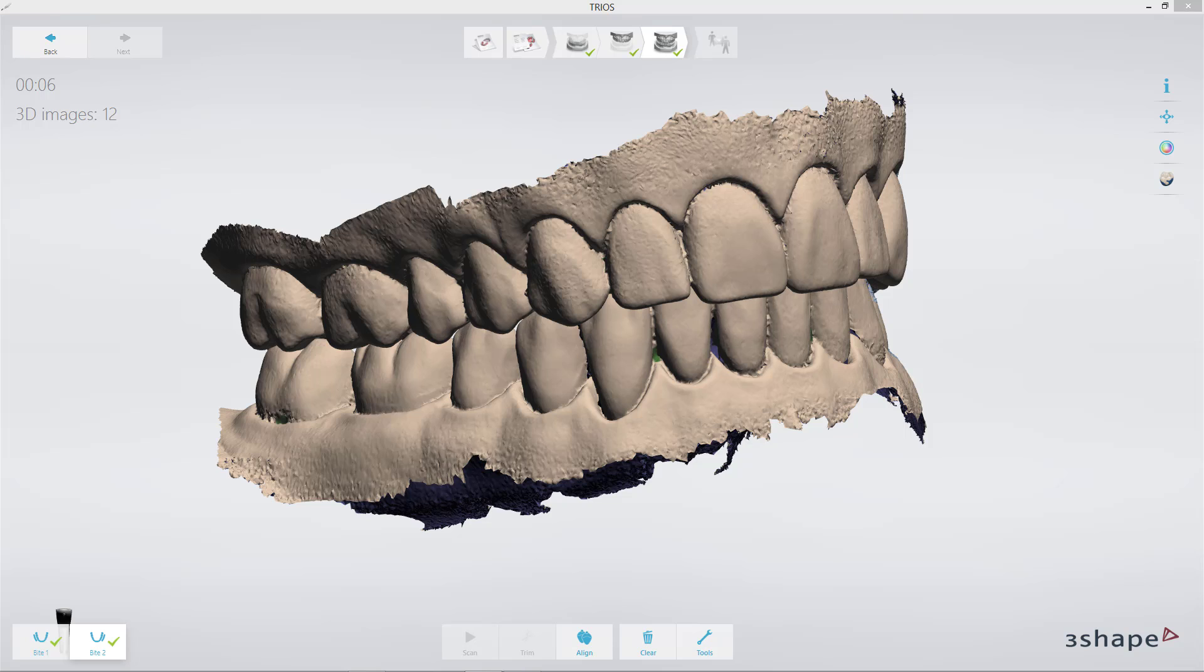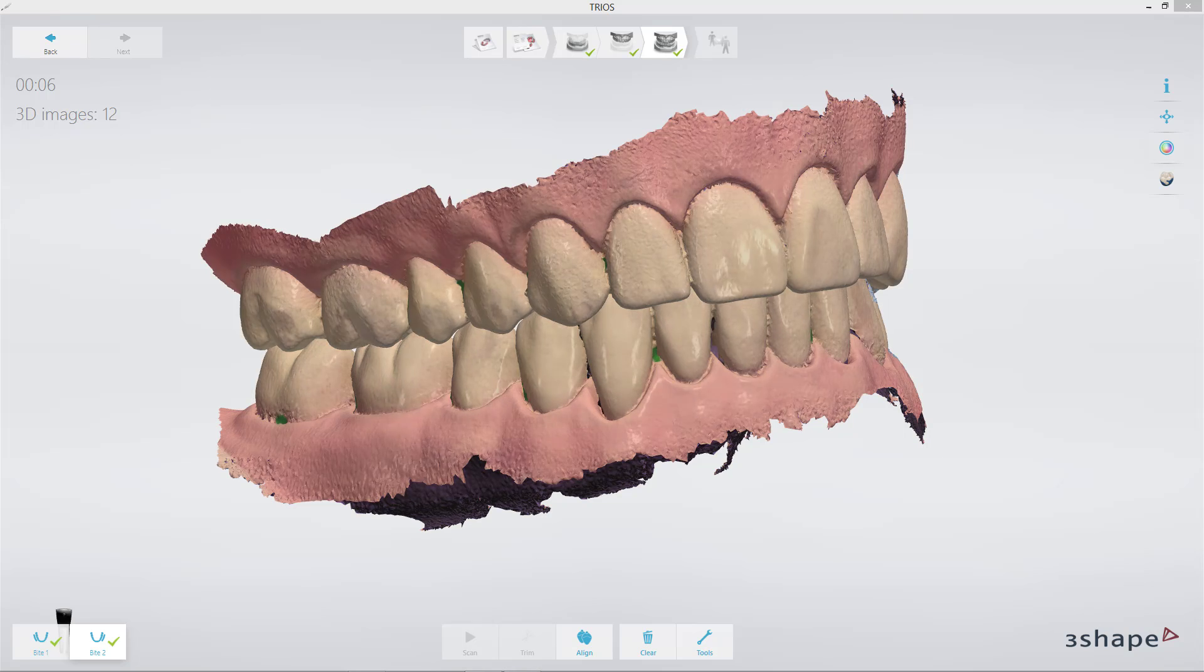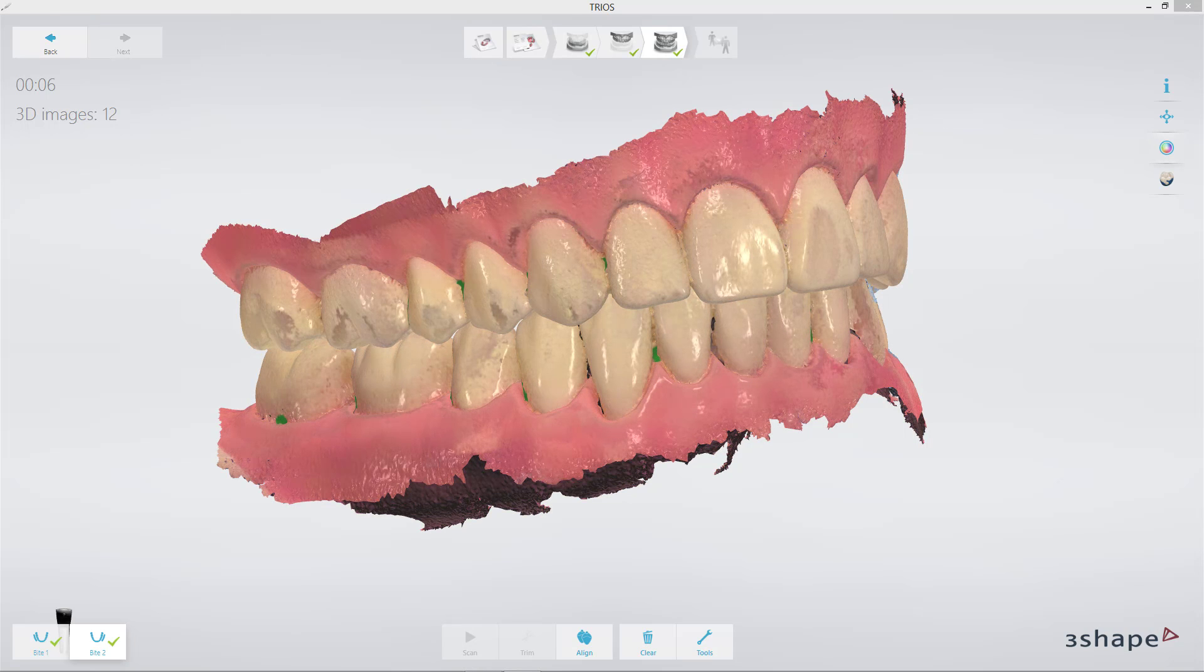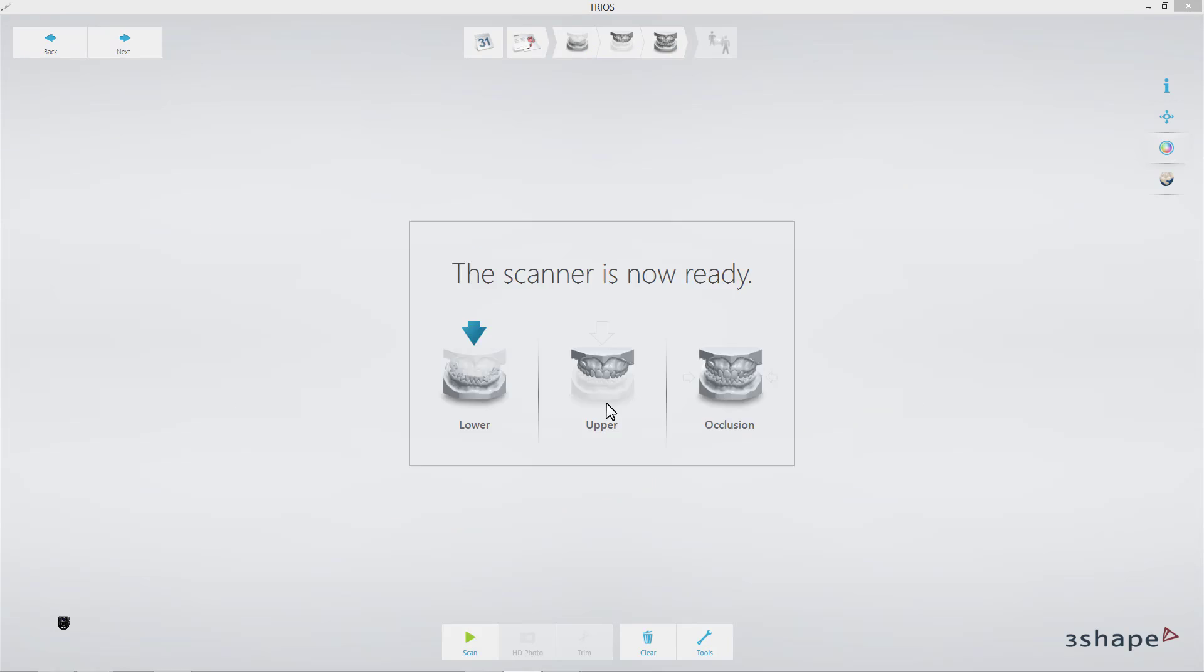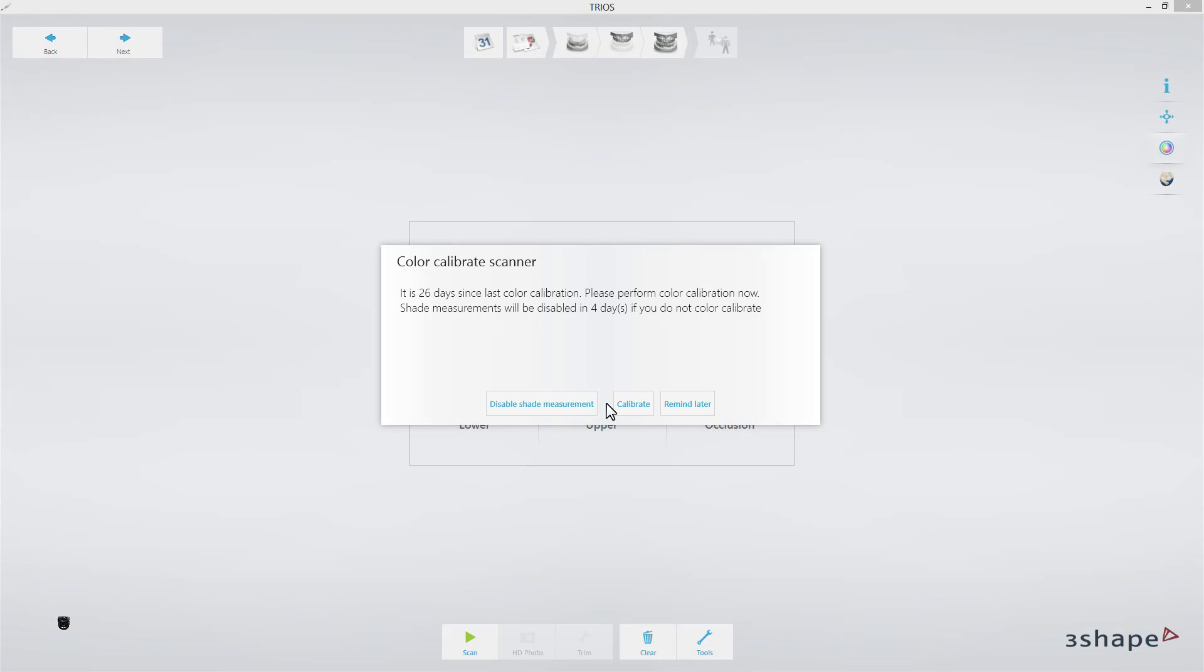Skipping 3D calibration might lead to degradation of quality of the scan. Outdated color calibration may have a negative impact on obtaining optimal color quality. Shades measurement will be disabled if color calibration is not performed for 30 days.